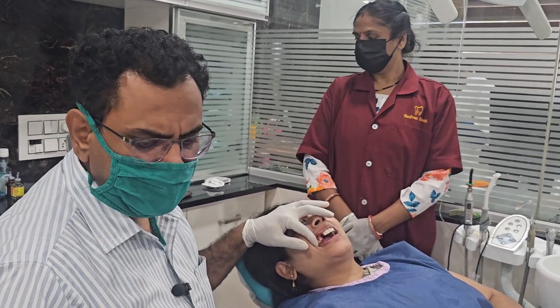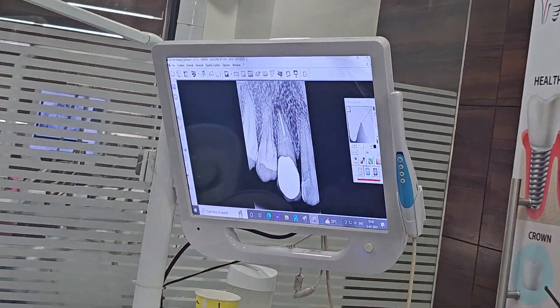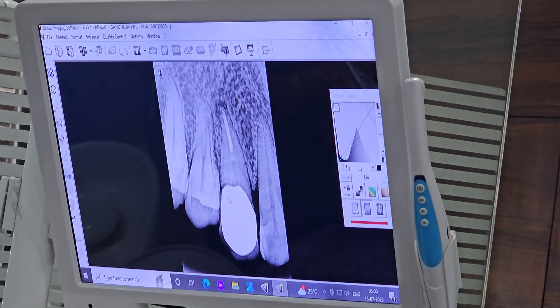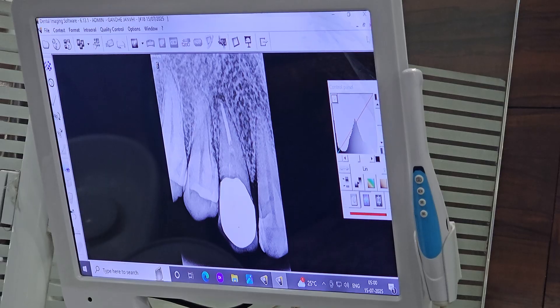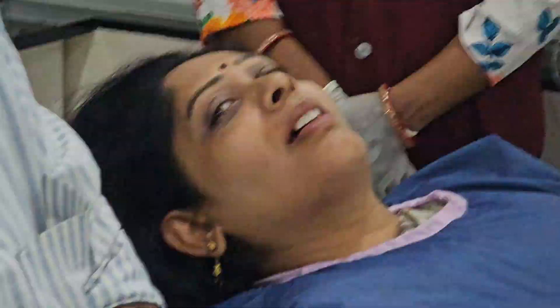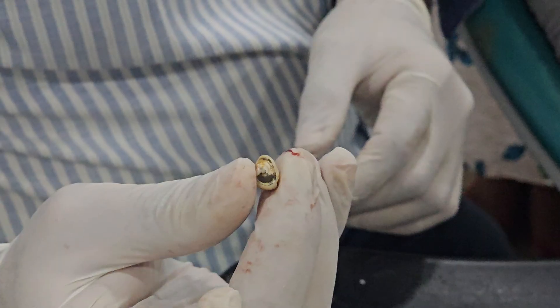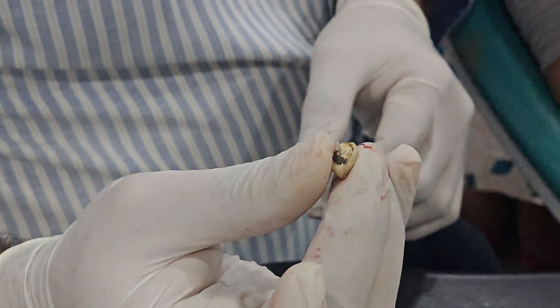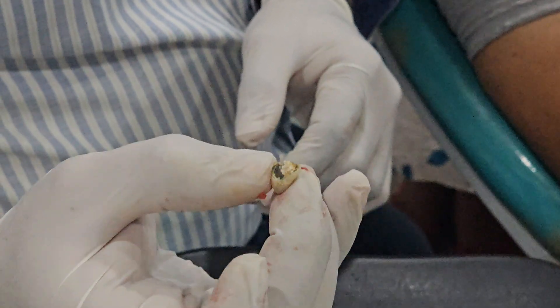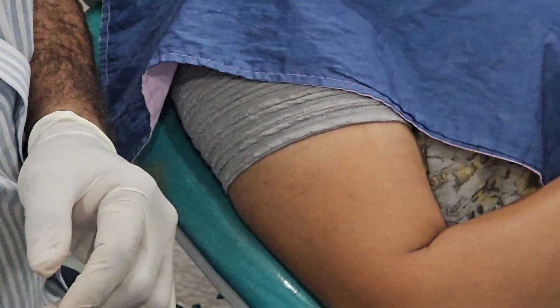I have already extracted this canine. You can see the pre-operative x-ray. The tooth was fractured at the crown level. A post and core was done but it was failing — twice or thrice the crown had dislodged. There was no ferrule. The tooth had broken and the crown had come out repeatedly. So we had planned for immediate extraction of the root piece and immediate replacement with basal implants.